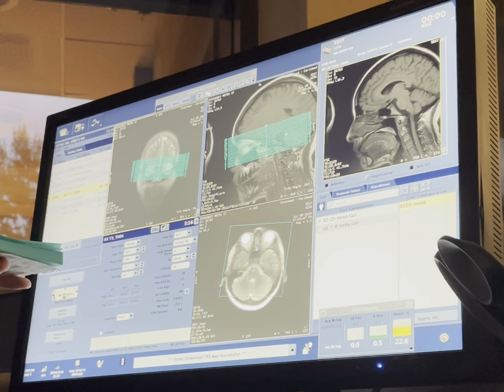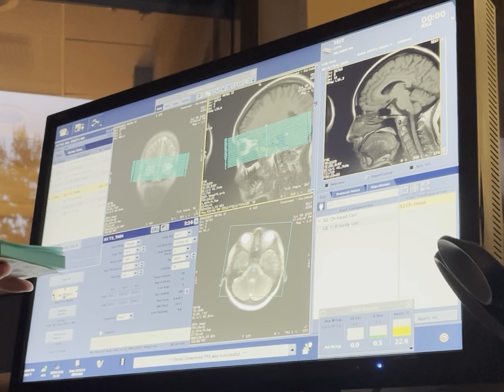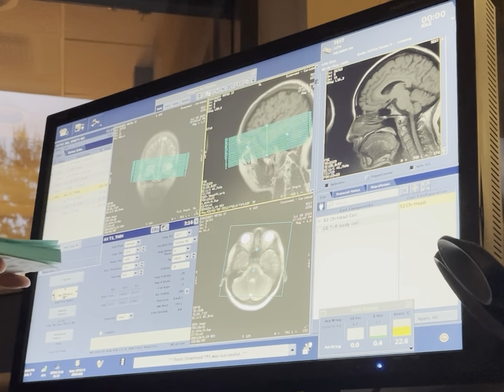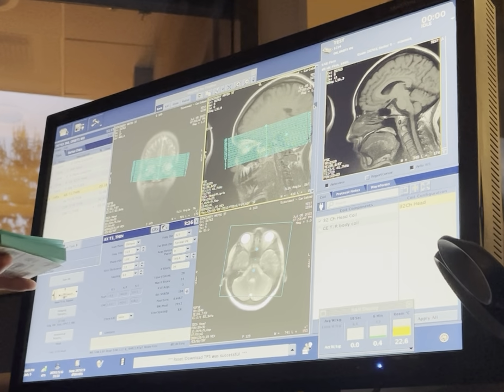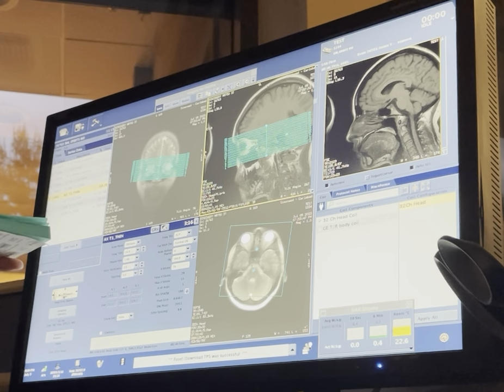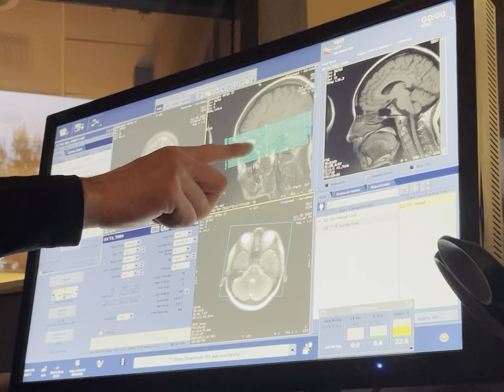In this one? Yep. Let's find it, right? Yeah, that's probably it, but let's check that. That's it for sure, but let's check the other slices just in case. Let's check the other eyeball after. Keep going. Yeah, so let's go back the other way. Oh, there it is. Go back. You see that? Yeah, so scroll through one more time. That's it, that black thing.